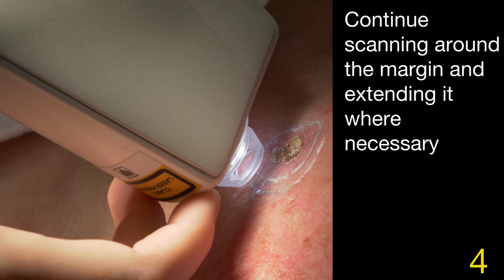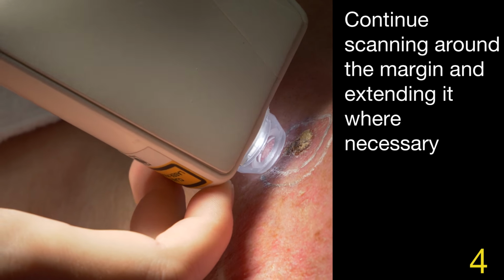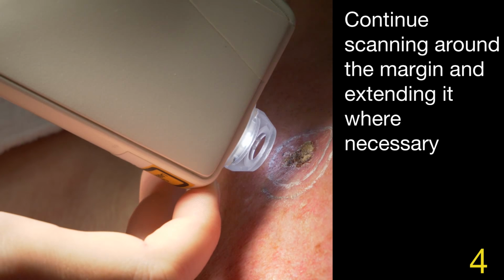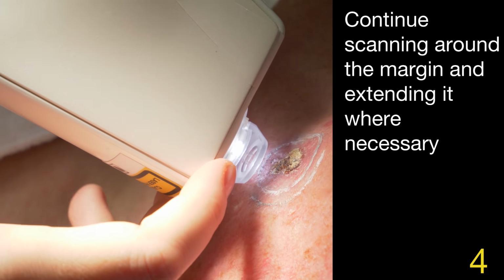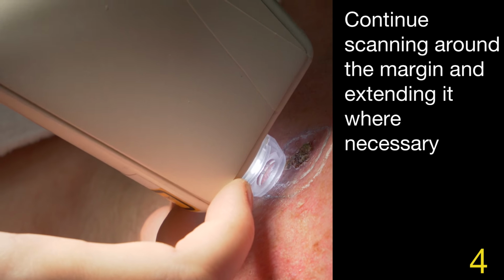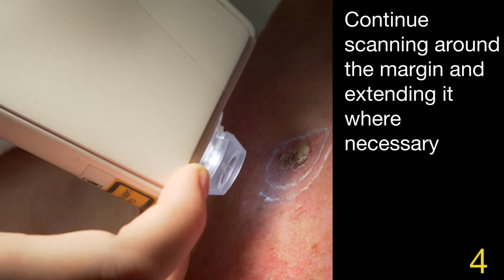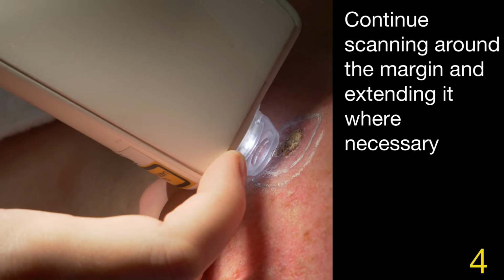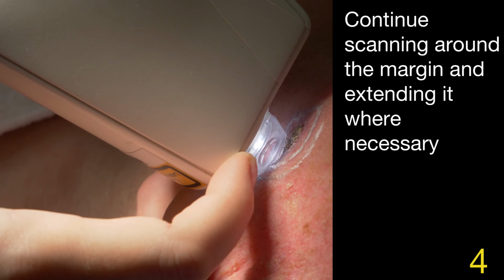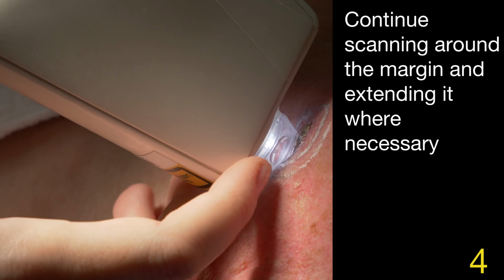So is there a technique to moving it around? Do you have to stretch the skin, or how much pressure do you put? No, not stretch the skin. It's just looking at the color camera and really do the positioning in the center. This is very necessary because you need to know where is the tumor part and where is the healthy part. And here we also see some tiny nodules, but not so much.